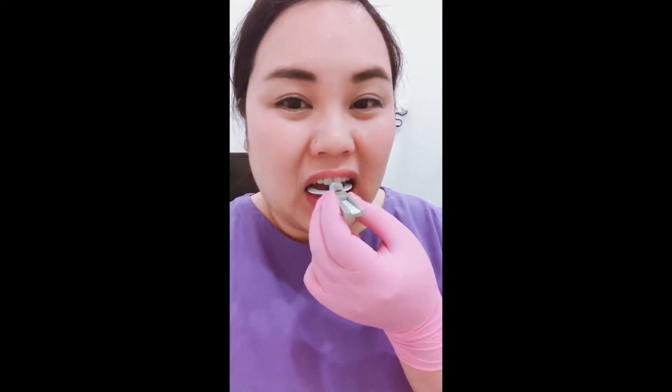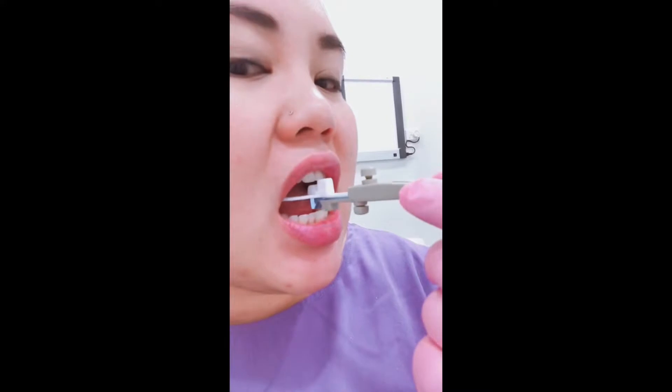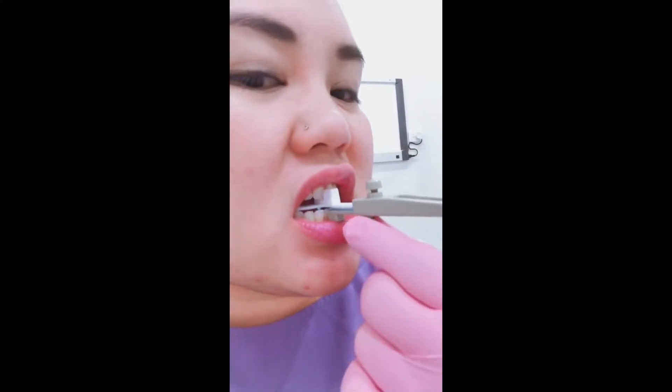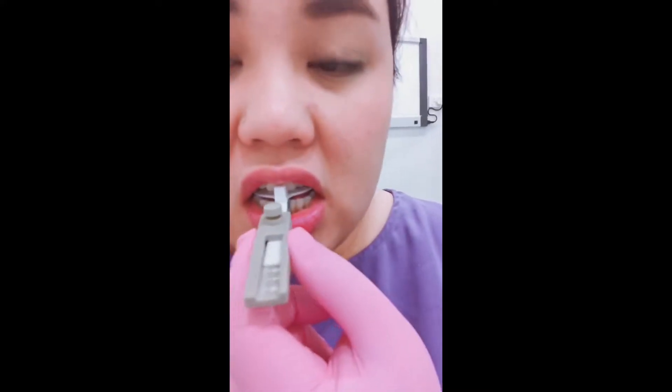Here I am trying it in, making sure that the lower incisor notch is centered over the lower midline. I'm closing into the upper incisor notch with the midline indicator between the central incisors. Occasionally you may have to modify this if the incisors are rotated or the incisor edges are excessively thin.